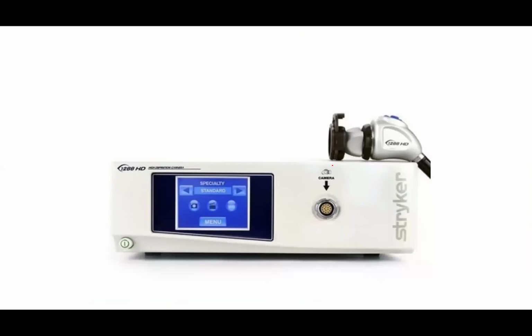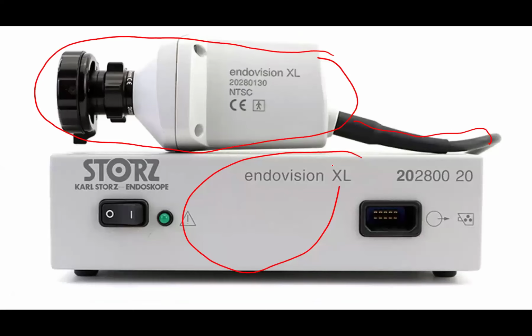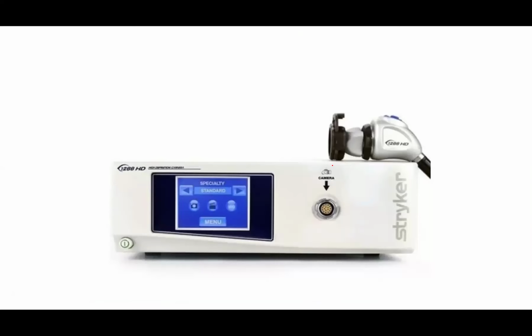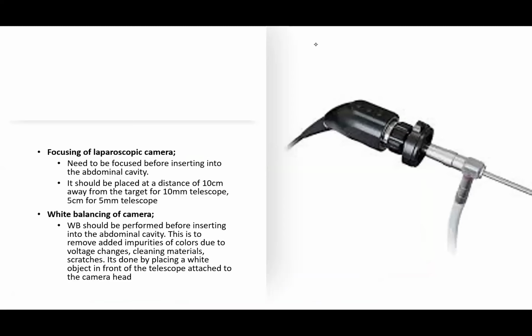These are common products we see in most centers: Karl Storz, Covidien product, that is Medtronic, or Stryker product. These are common laparoscopic HD devices you see in some centers. Okay, how do you focus? How do you focus a laparoscopic camera?